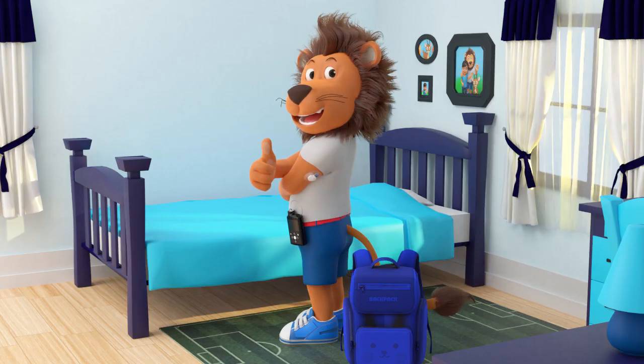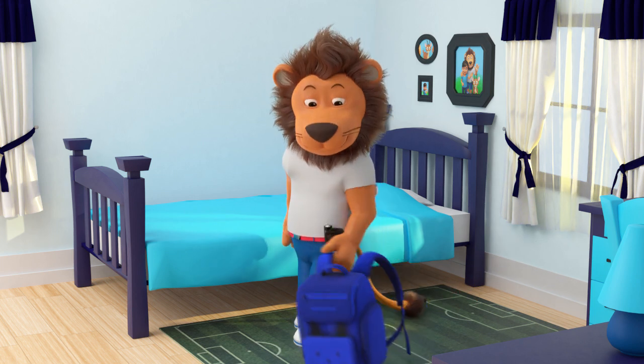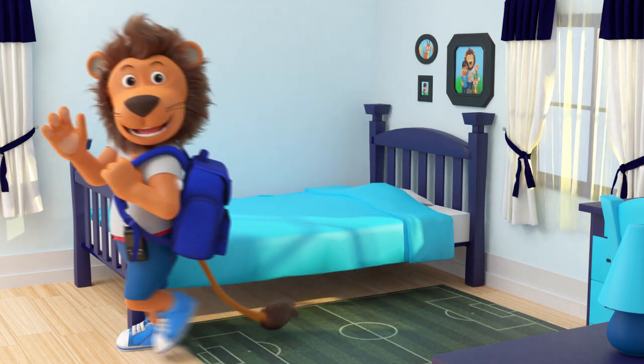And hey presto! Your new sensor is on, the sun is shining, and you are ready to start your day.